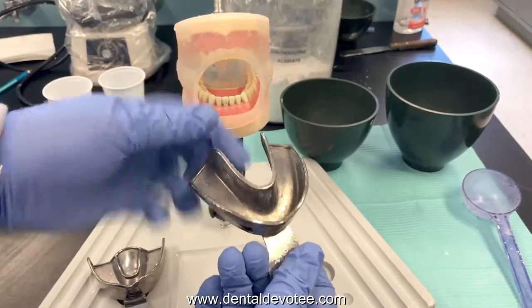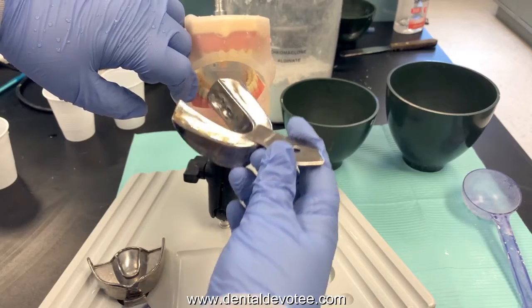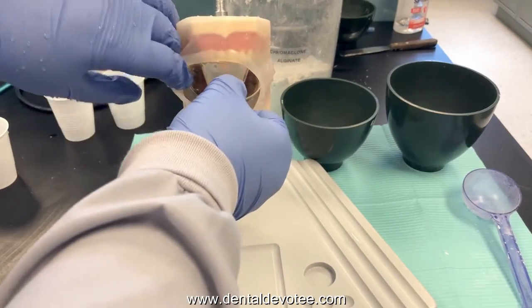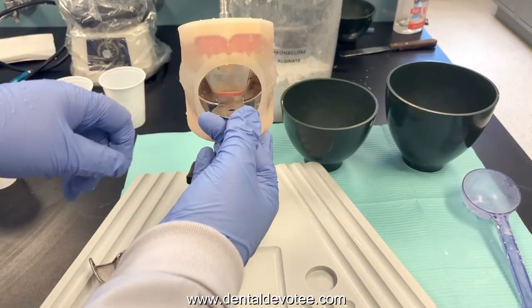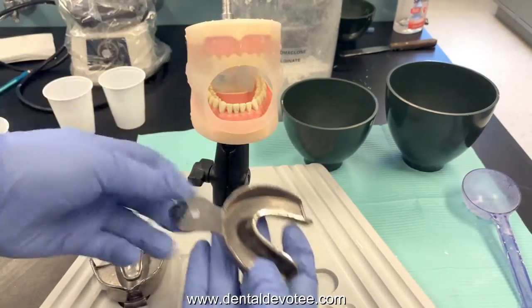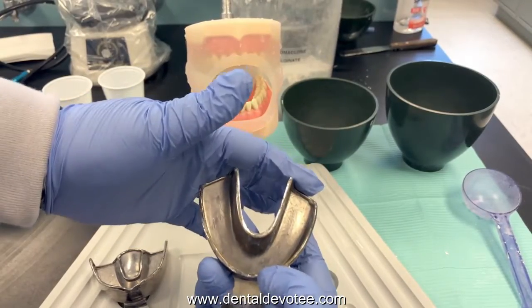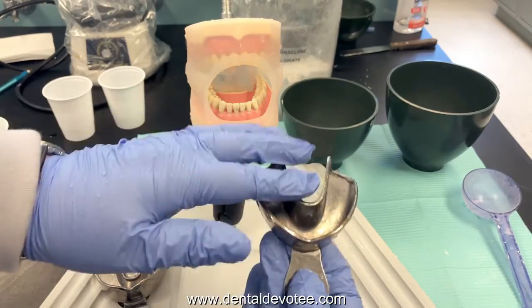Try in your trays at an angle. I'll do mandibular first, so this has to be facing down. Retract one cheek with one hand, insert at an angle — that will help stretch out the opposite cheek. Seat the posterior first and then swing the anterior down, making sure the tray covers the retromolar area. Have the patient lift their tongue up and out, making sure it does not get trapped. If you have a good fit, remove the tray again at an angle and ask the patient if it pinched anywhere. If it pinched or felt like it was rubbing, or if the tray was too short, you can add wax to modify the tray.